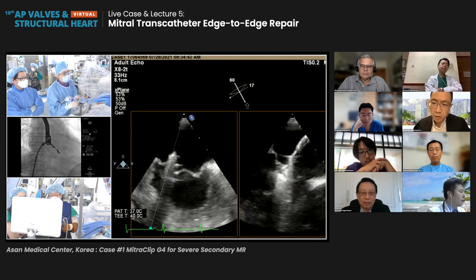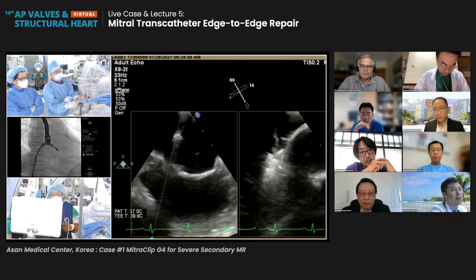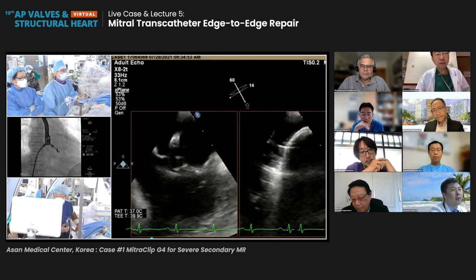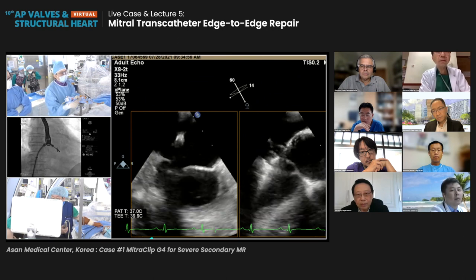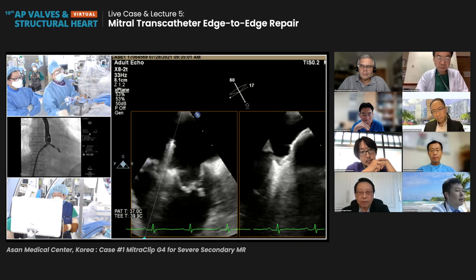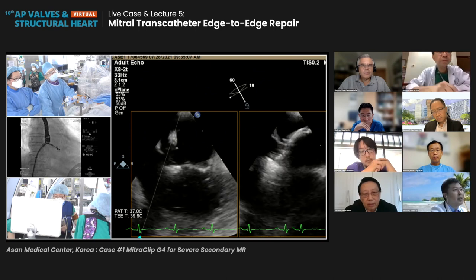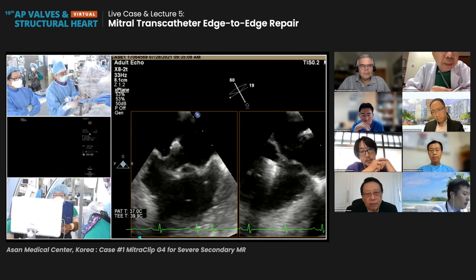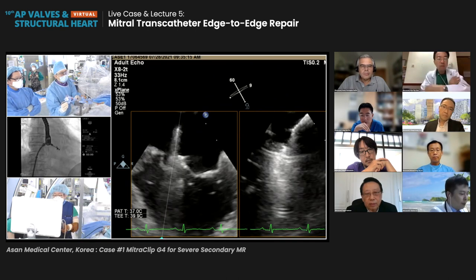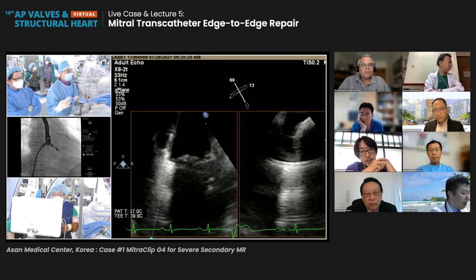Sometimes if it's too hard to see the clip arms, it may be helpful to go to a dedicated LVOT view, because you're medial, so the standard views may not work that well. Posterior seems to be caught. Do you think the posterior leaflet is entrained in the clip system? That's just a lot of shadowing. Yeah, the echo image is not so good now.